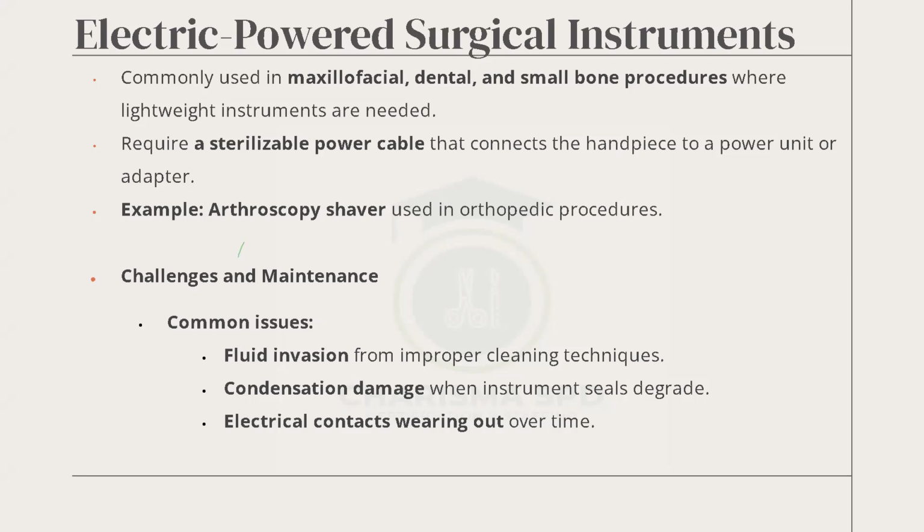Challenges with this electrically powered instrument is fluid invasion. So the shaver in my hospital, you don't pass it through the washer, we hand wash it. So it is manually washed. You use your hand to wash it so that you can prolong the lifespan of the instrument. Condensation damage when the instrument seals degrade. All right. When instrument seals degrade.